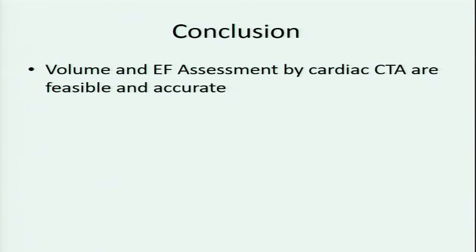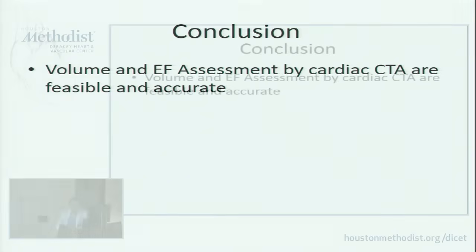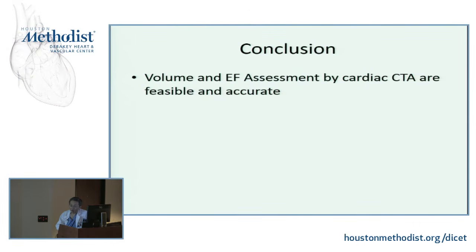So basically, volume and EF assessment by cardiac CT is feasible and fairly accurate compared to MRI and echo. But again, the main message I want to transmit to the fellows is you need to know, if LV function assessment is required, what kind of protocol you're going to prescribe, depending on the radiation dose, the contrast, the renal function, and the clinical question.